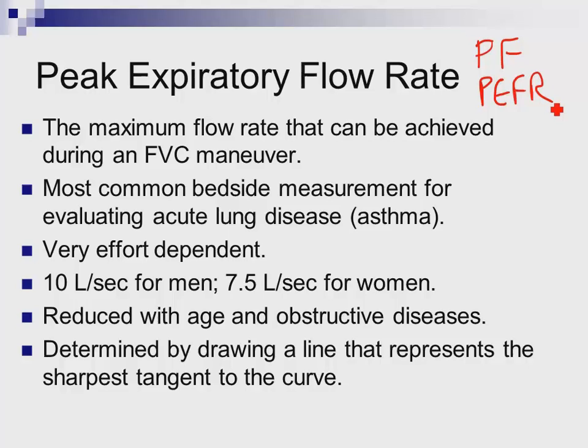The problem with peak flow is it's very effort dependent. The other ones I've been talking about up to this point are not effort dependent. Take a deep breath and blow it out hard. No, blow it out hard. If I'm looking at how much you can blow out in 1 second, it's hard to fake that. It's easy to fake this. So you really have to monitor the patient, make sure they're doing the maximal effort at that point in time.